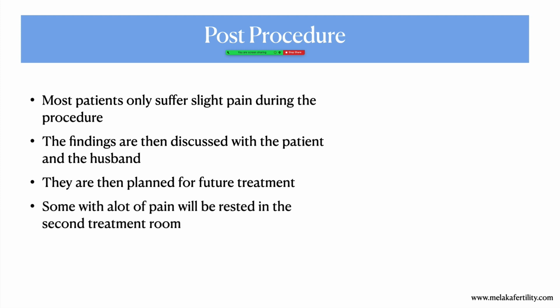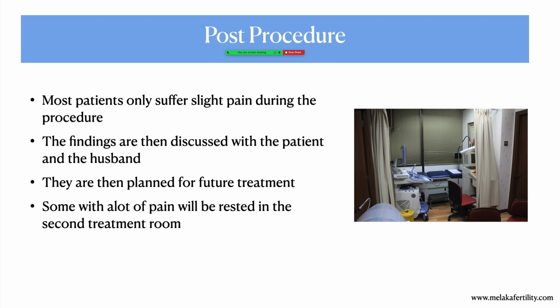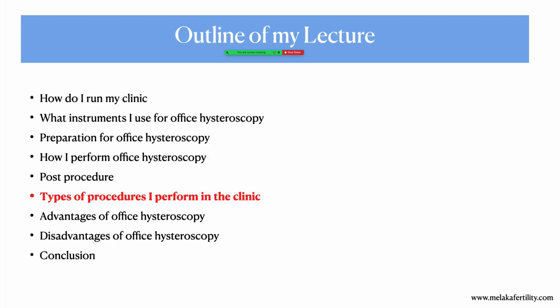And some patients will have some pain. If they have pain, then I'll rest them in my second consultation room. There's another couch there, and they will be rested there. And very rarely they will require a second analgesic.